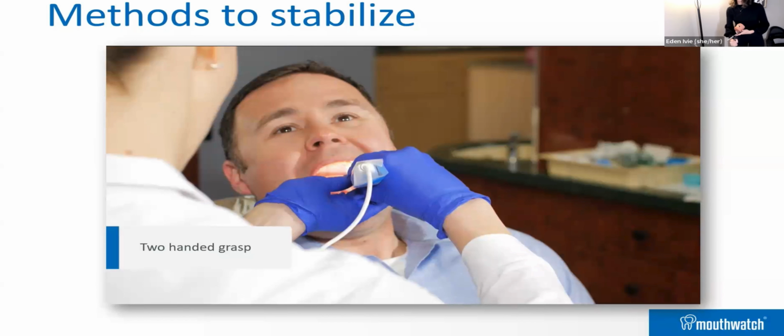Okay, got my guy here. All right, so I'm going to go this way with the two-handed. So what I really like to do, I like to get as many points of contact on my patient as I can. And then I come in with my camera and I can either grab this with my thumb, I can balance on my hand. Let me show you a picture of what that looks like.